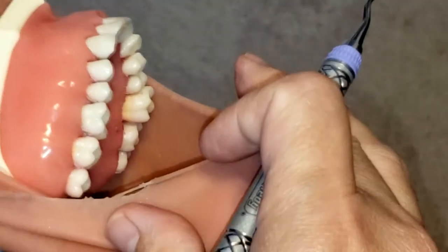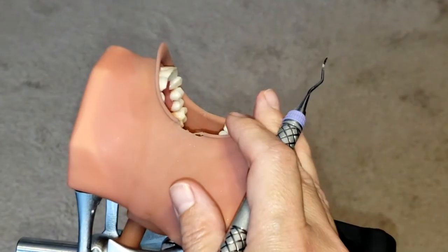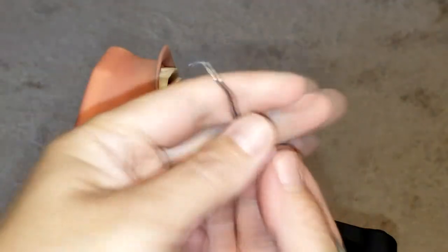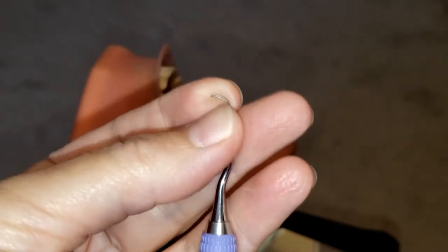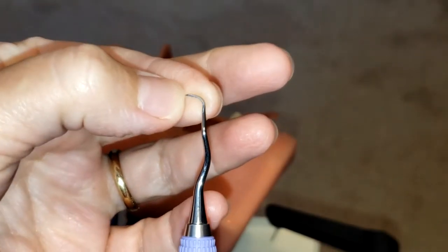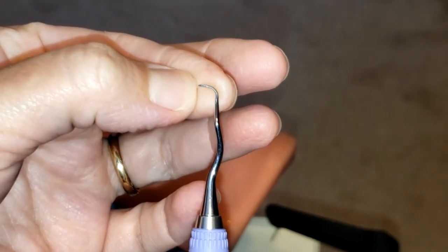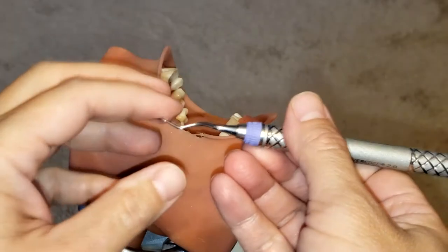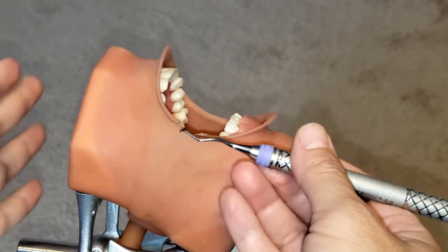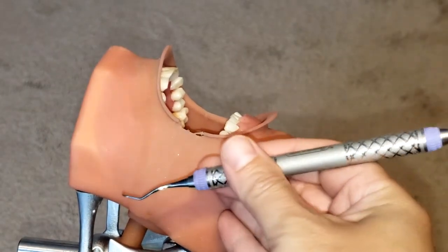Before we begin, it is very important to know that you have to make sure you are using the toe third of the instrument — so the side of the instrument, just the toe third right there — in order to remove the calculus. That is what should be in contact with your teeth at all times.